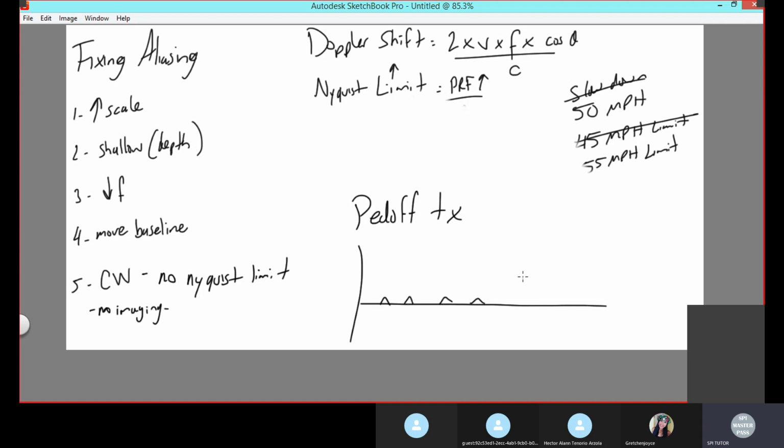And you're like, oh, okay, okay, okay. I'm somewhere, I'm getting close, I'm getting close. And then you move it around ever so slightly, then you're like, okay, okay, I think I'm getting close. All of this is by sound. You just try to move in the right direction. And then eventually, you're like, ah, aortic stenosis.